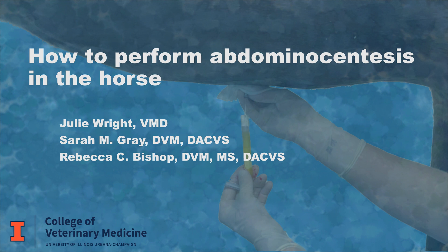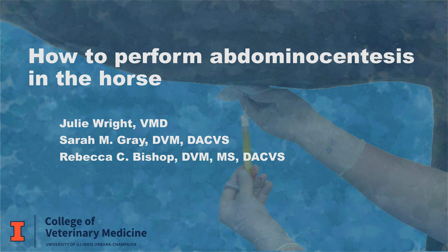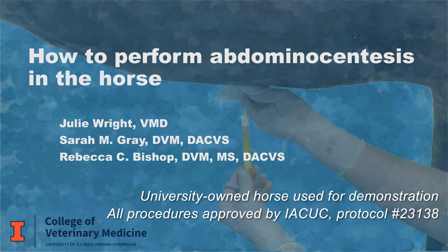In this video we will demonstrate how to perform an abdominocentesis in a horse. Analysis of abdominal fluid can be useful in horses presenting with acute or recurrent abdominal pain, unexplained weight loss, unexplained fever, or other abdominal cavity conditions. This procedure can be performed in a clinic or in a field setting.